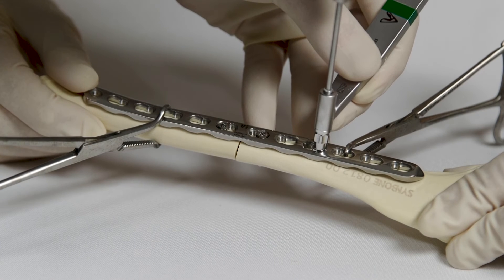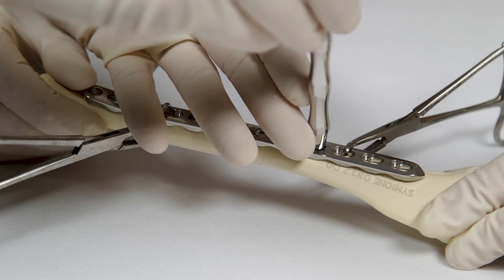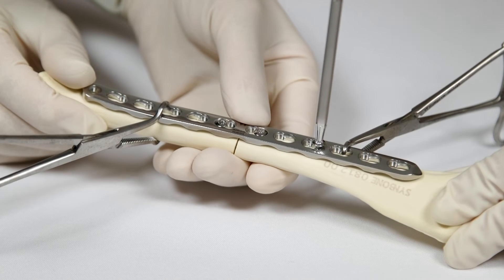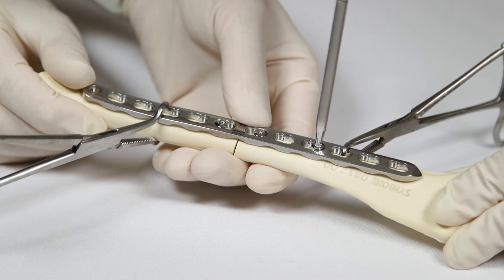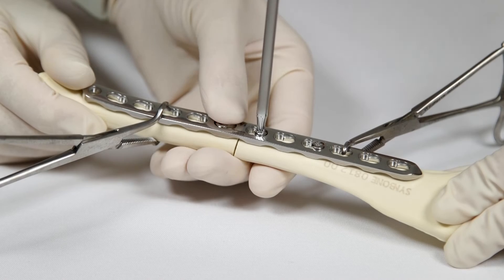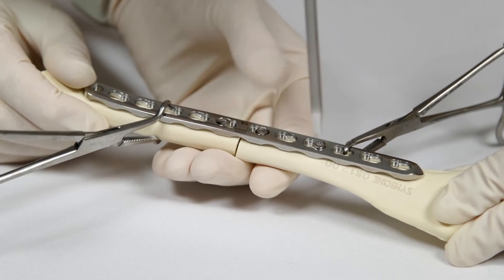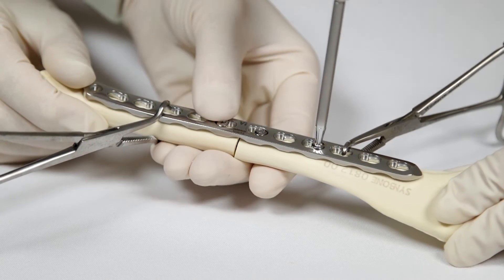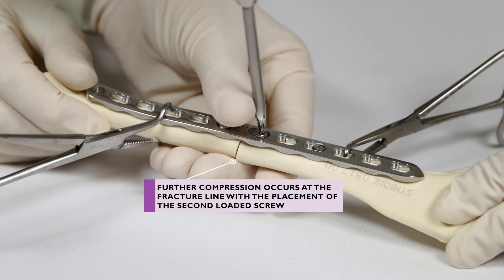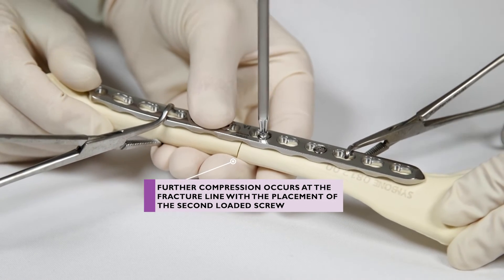A further compression screw may be applied on both sides of the fracture if necessary, but it is very unusual to need more than two compression movements. The first screw should be loosened half a turn as the subsequent compression screw on the same side of the bone is tightened, to allow the bone to move. This screw must then be re-tightened once the compression screw is in place.